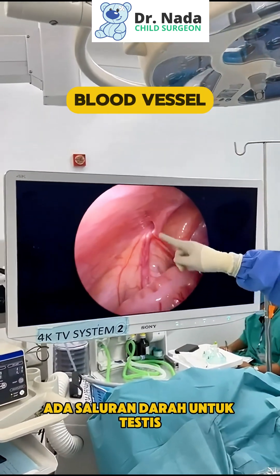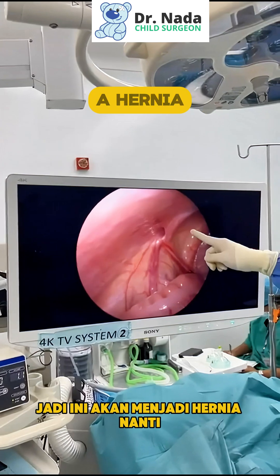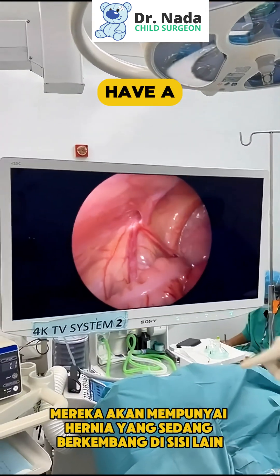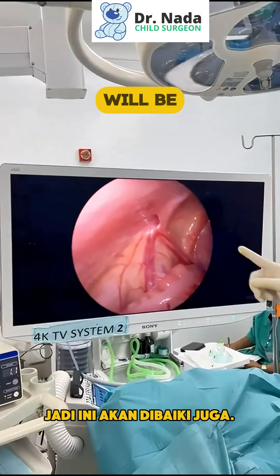You can see this sperm cord — this is a blood vessel of the testis. So this will become a hernia later, so we repair this. Fifteen percent of boys will develop a hernia on the other side, so this will be repaired as well.